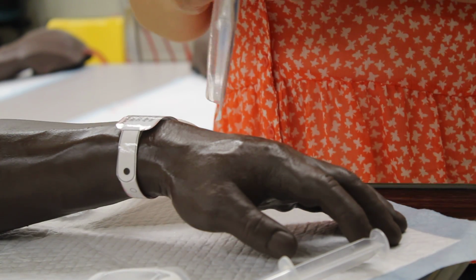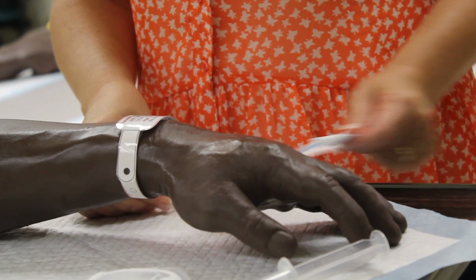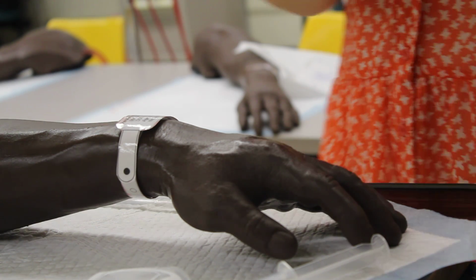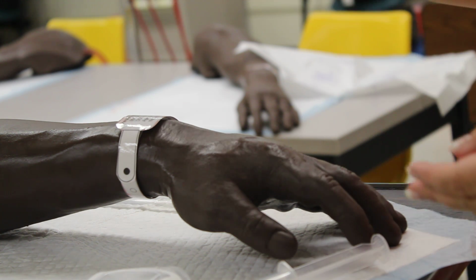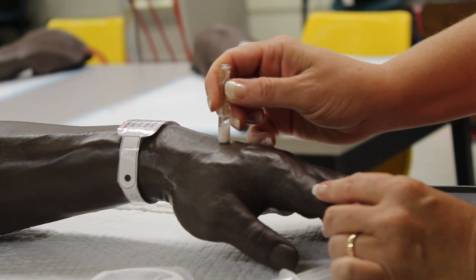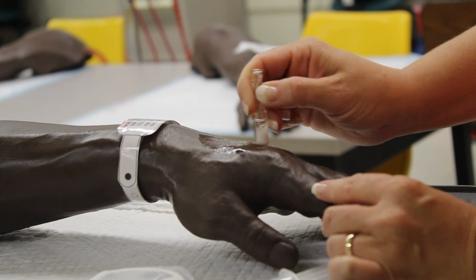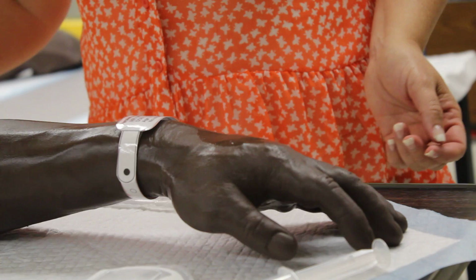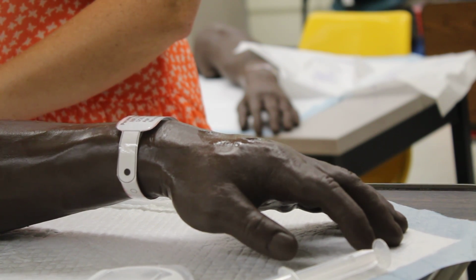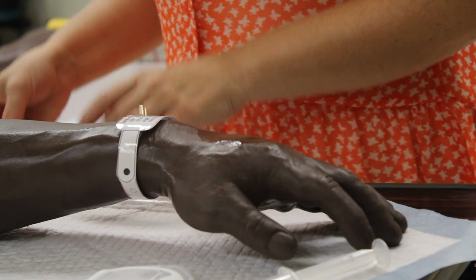I'm going to go ahead and open up my catheter. Have it ready, and then I can get my cleanser, locate my vein that I'm going to use. You open the ampule by just pressing it and cracking it. The chloroprep will go into the tip, and I'm going to start my IV right here. So I'm going to work from the inside out, cleaning that and then allowing it to dry. While I'm waiting on that to dry, I can go ahead and initial, date, and write the gauge of my needle on the dressing that I'm going to use and have that ready.